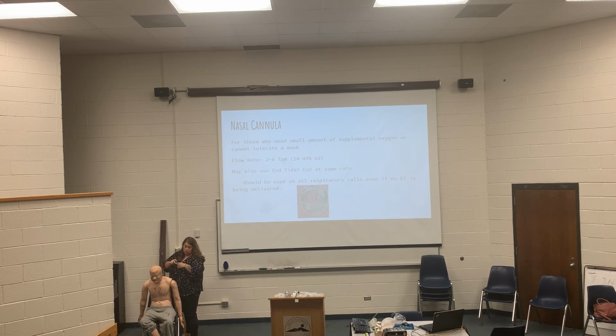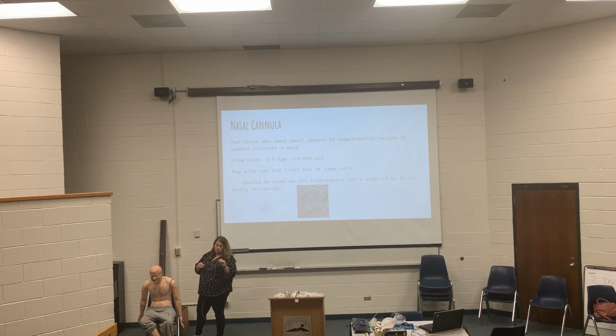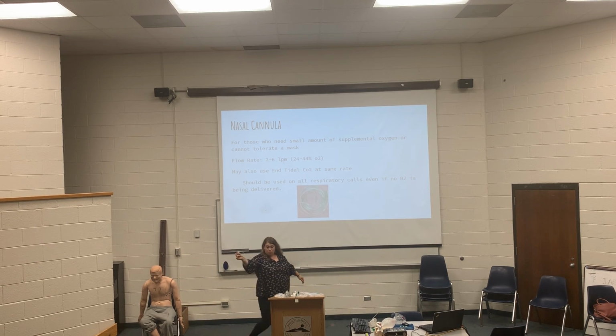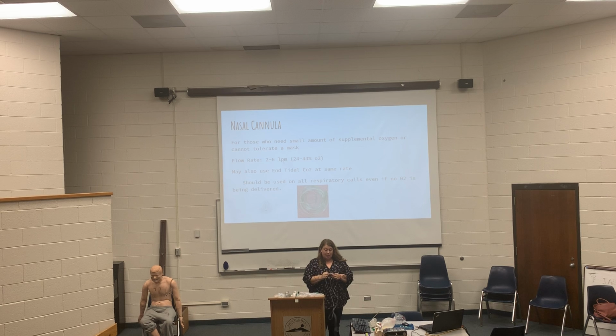But if they don't use supplemental oxygen, I'm sorry, Veronica, you can't see very well over here. But if they don't use supplemental oxygen, get a room air reading, and so you'll put it on them, and they're gonna hate it. This little bubble is annoying. If they don't have any teeth, they're constantly chewing on that bubble, and you have to tell them not to. But this little reservoir is what gauges how much CO2 they're breathing out. And remember, if they're breathing too fast, their CO2 is going to be low. If they're breathing too slow, their CO2 is going to be high.